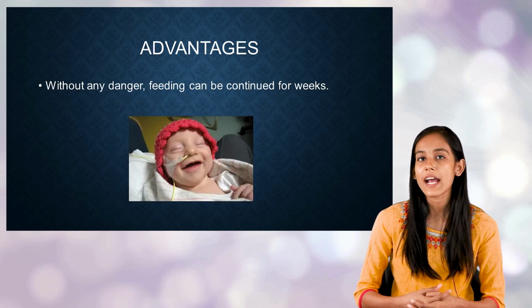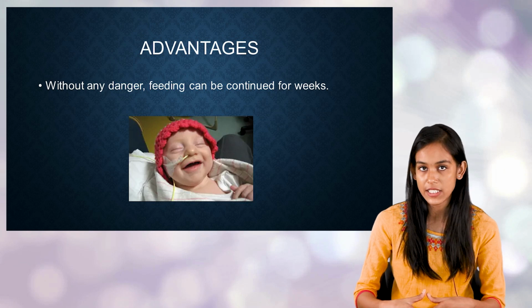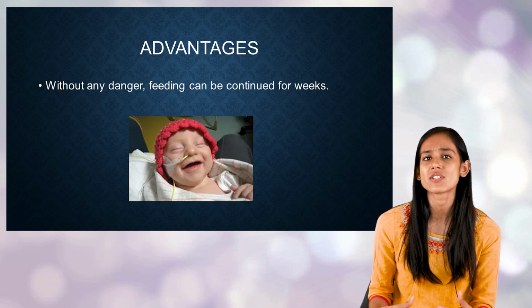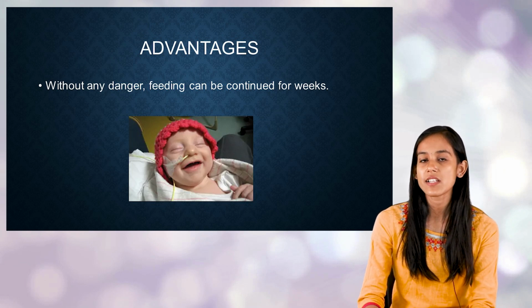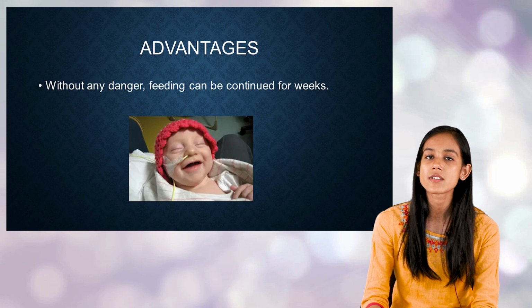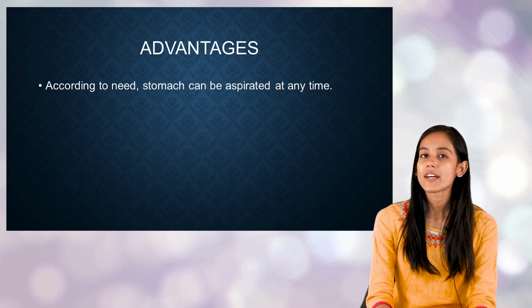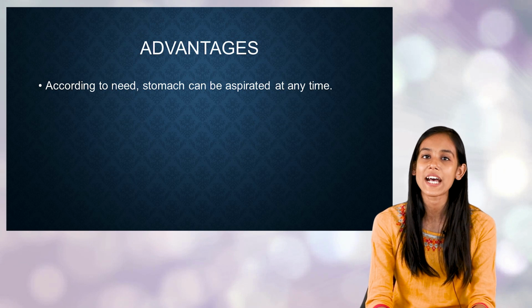The next thing is that it can be continued for weeks without any danger. It doesn't pose any major danger to the child's health. So it is a very safe process of providing food to the child. Now, there might be certain incidents or certain times where there is a need to aspirate the stomach.